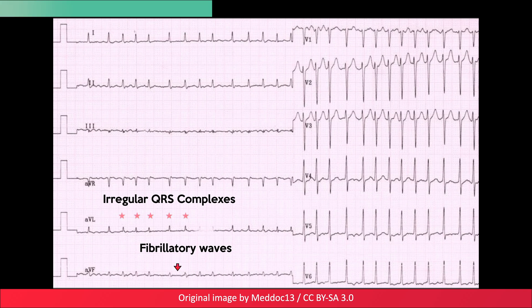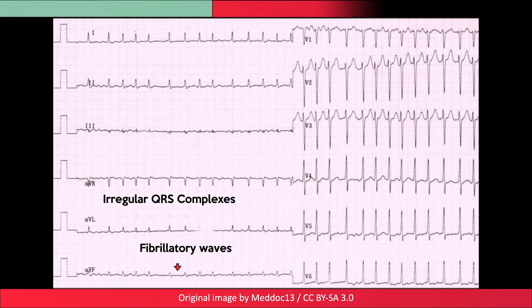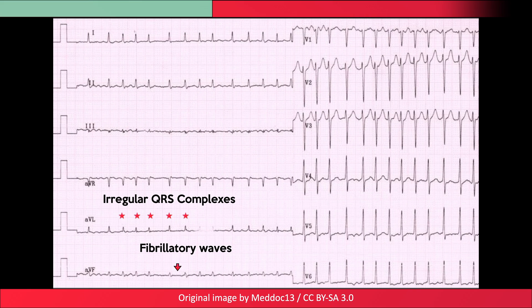Grouped QRS complexes, however, may give the appearance of a regular rhythm. Furthermore, in the presence of a complete heart block, a regular escape rhythm will be present.